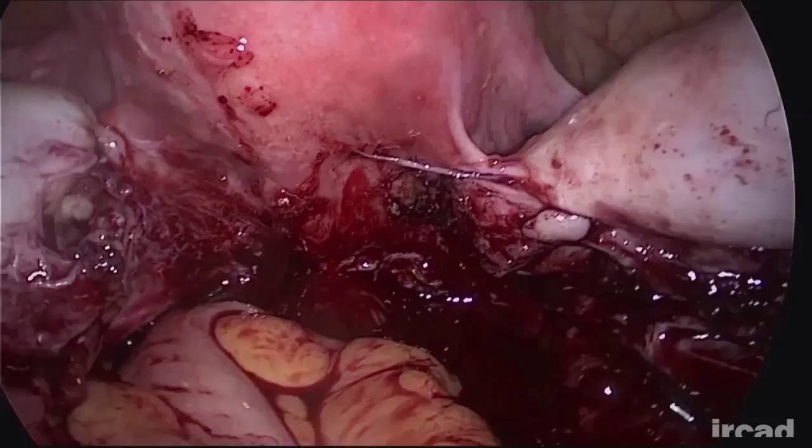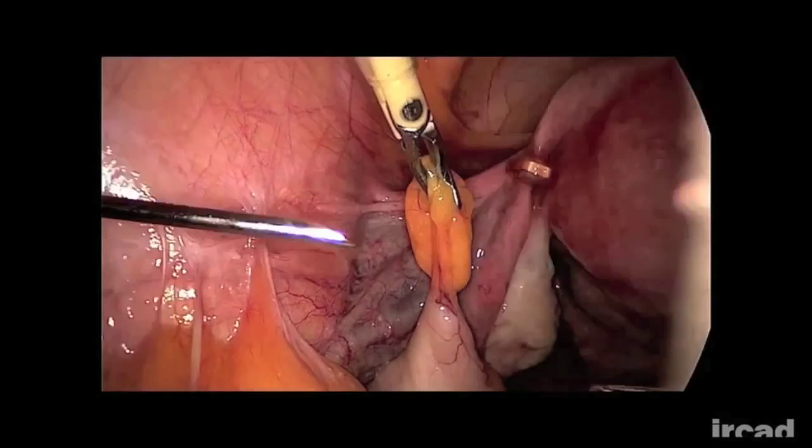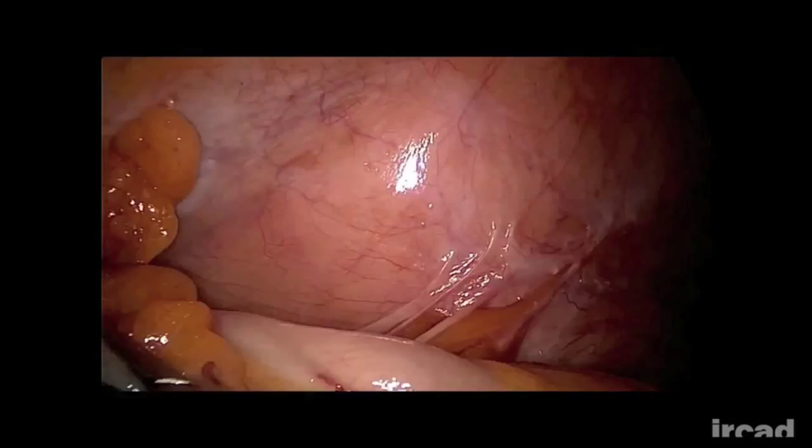During sacrocolpopexy, the sigmoid is suspended at the level of the left flank. The inserter is passed through one or two epiploic appendixes and the T-Lift is pushed and applied in a J-shape configuration. The assistant gently pulls up the sigmoid as the device is retracted, reducing tension on the epiploic appendixes.